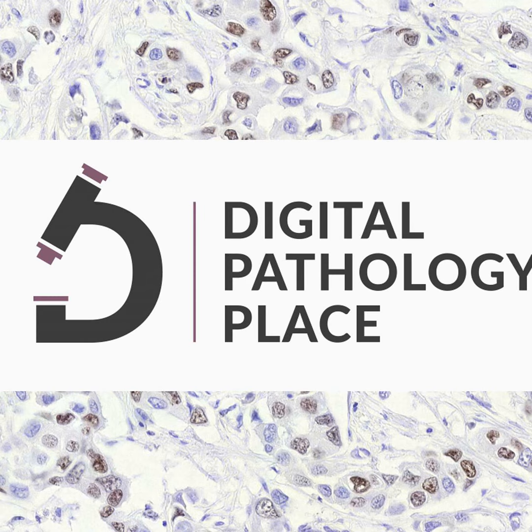Here they were working with MRXS files. These are files from the 3DHistech scanner, and they had two ways of making them into DICOM. They converted these files depicting bladder, ovarian, and prostate tissue into DICOM images using the 3DHistech Sysmex converter and an open source tool, both using baseline JPEG for the recompression.